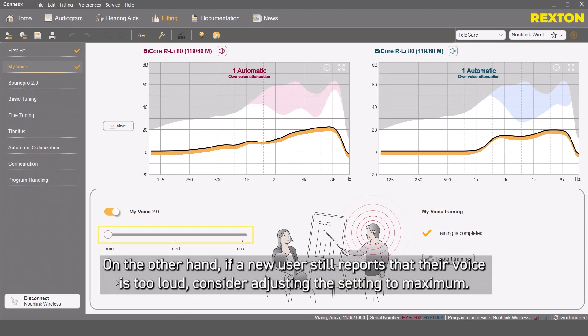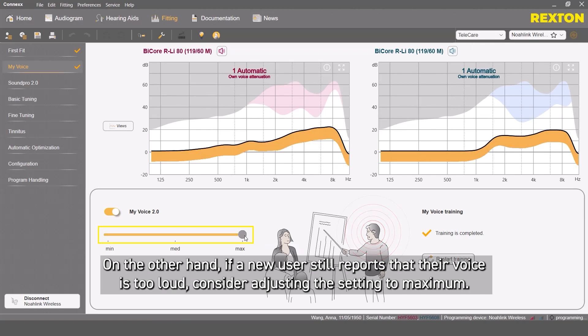On the other hand, if a new user still reports that their voice is too loud, consider adjusting the setting to maximum.